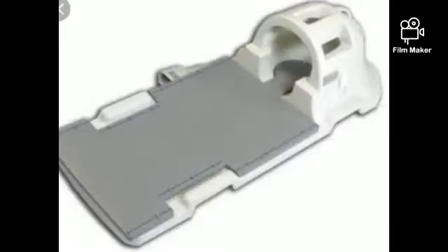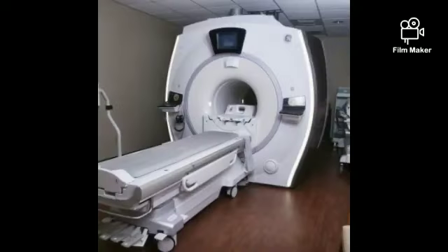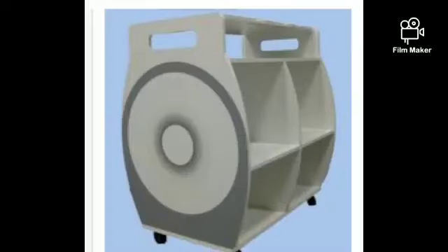So these are the neurovascular array coils. Here more than two coils are connected, and the coil types are phased array type, and we are increasing the larger area coverage with this type of coil. Even the patient couch is now a type of MRI coil. Here we can do whole spine MRI as well as lumbar spine MRI with the help of this patient couch. No need to place the coil because the coil is always placed inside the patient couch.